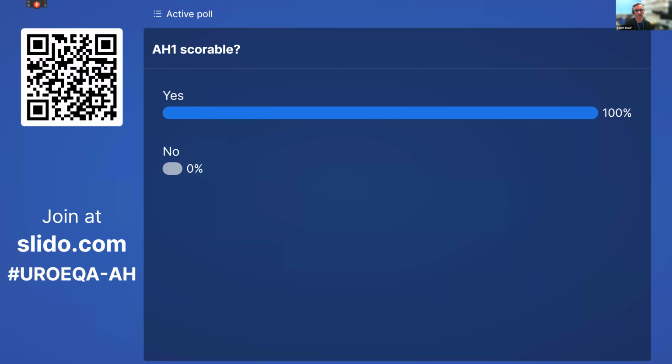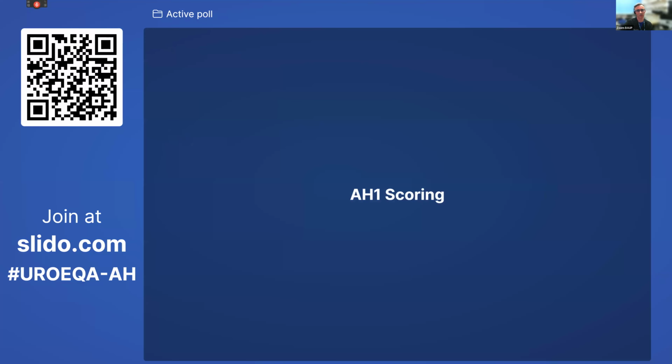Yeah. So most people. So shall we start off with the scoring first of all? So right. Okay. So AH1 scoring. So you should be able to see the actual scoring on your phones.